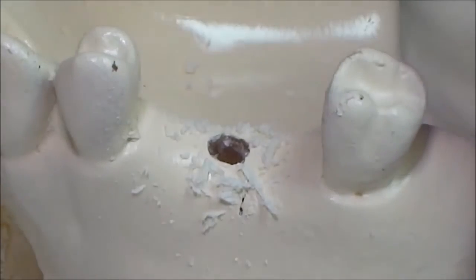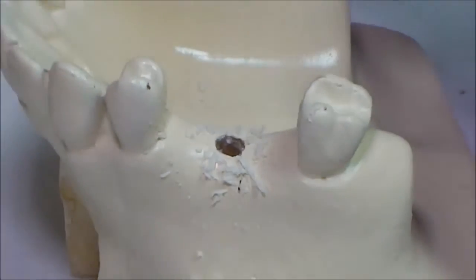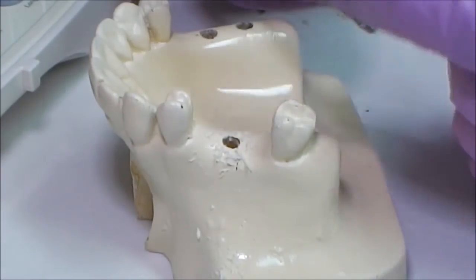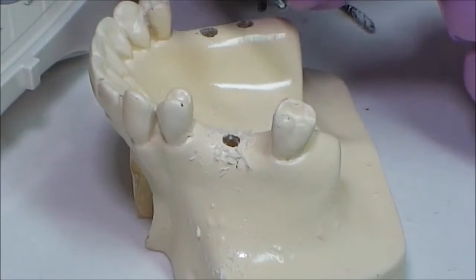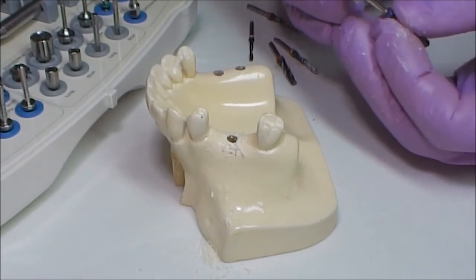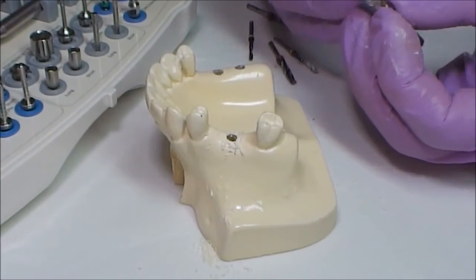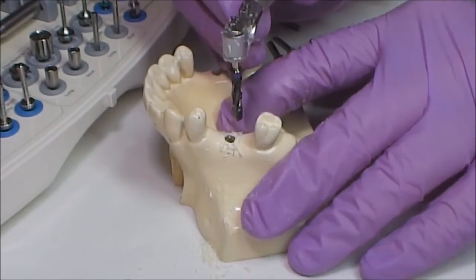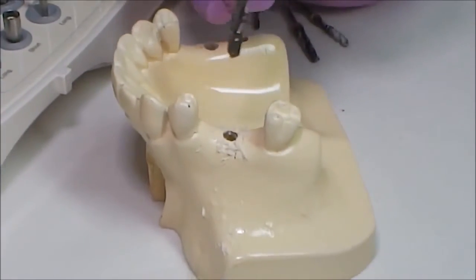We draw your attention to the fact that all Beer 3 drills are of high quality and have a diamond-like coating. Due to this, they are extremely sharp and do not overheat the bone. The next drill is 3.9 millimeters in diameter; drilling with this drill allows installation of a 4.2 millimeter diameter implant.